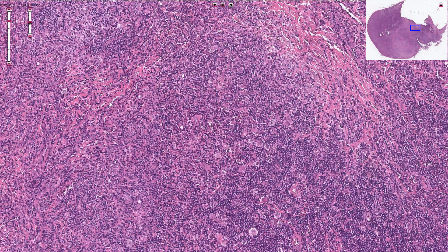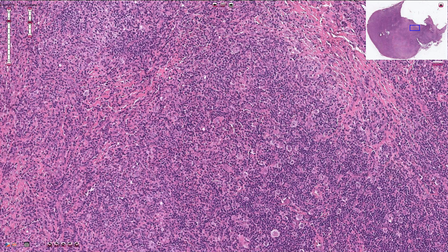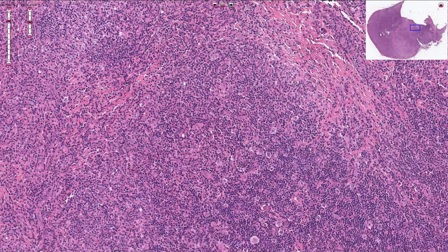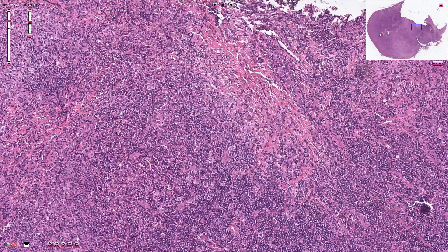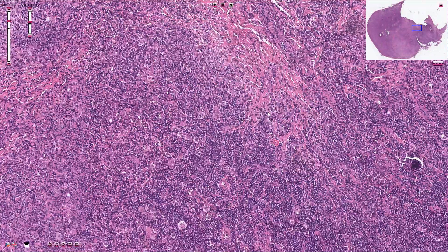Sometimes we can also see mild fibrosis with collagen fibers that are usually quite sparse and do not create nodules. We should not see the thick collagen bundles as in the case of nodular sclerosis.